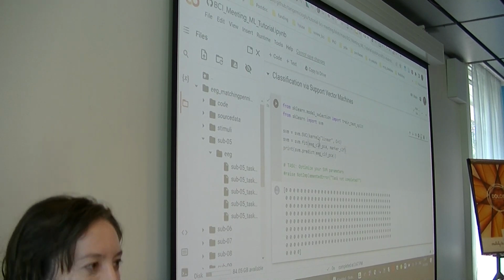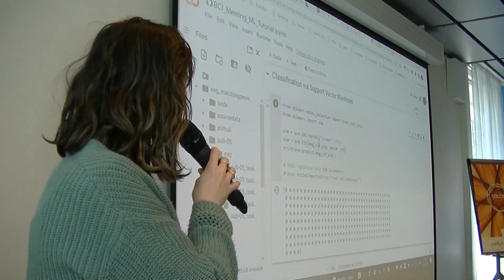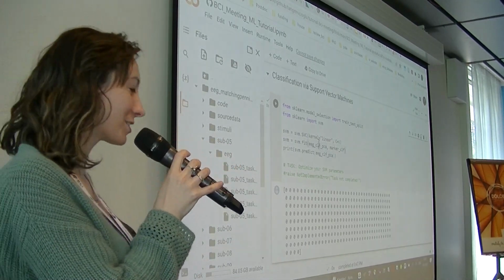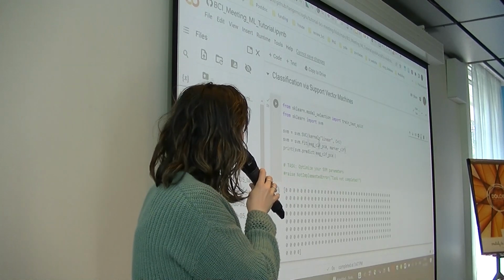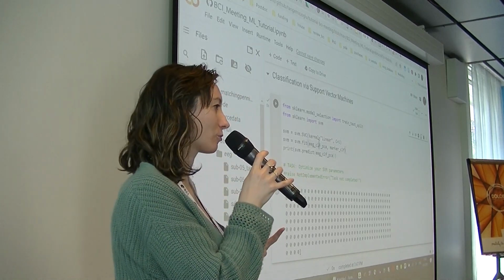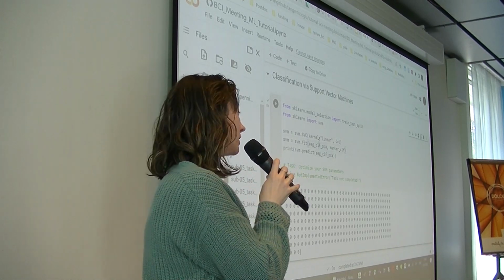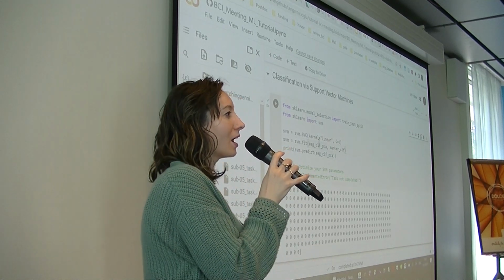All right. So we can see that we built a great classifier, and we'll challenge you guys to do a much better job. Things to try out, I would recommend is normalize the data, try some other transforms, see whether the PCA that we built here is the best, play around with parameters.